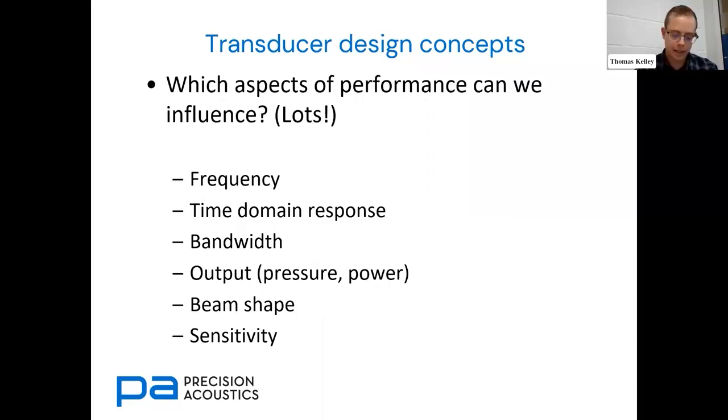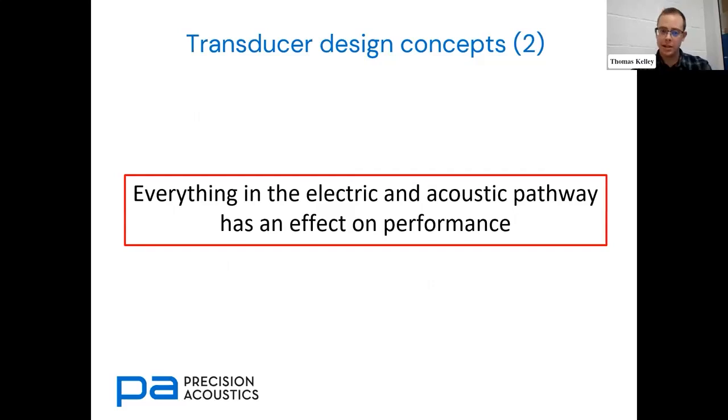I'd say, in fact, it's such a key concept that everything is linked to everything else that it probably deserves its own slide. So the first key takeaway is that everything in the electric and acoustic pathway has an effect on performance. I really do mean everything.